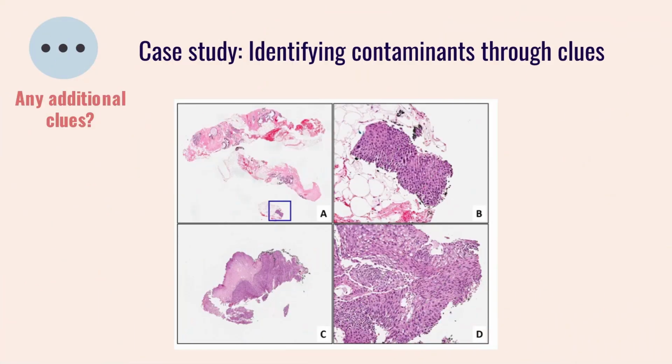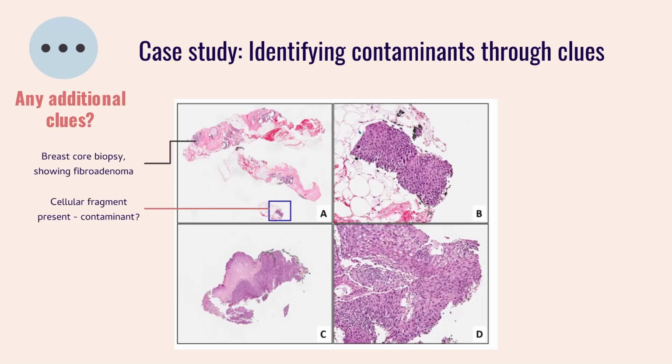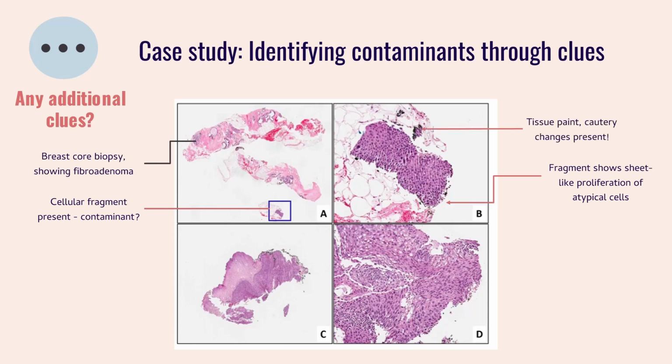Let's look at how one can apply this in a case scenario. This is a case of a breast core biopsy showing fibroadenoma, but with a cellular fragment in one corner and wedged between fat. This cellular fragment shows a sheet-like proliferation of atypical cells. One may wonder if this could be native tissue, indicating a focal area of DCIS perhaps. However, the keen observer might notice that tissue paint and cautery artifacts are present in this fragment, both of which are not usually seen in a breast core biopsy. The source of the contaminant was later traced to a looped electrosurgical cervical excision specimen with high-grade squamous intraepithelial lesion, where cautery changes and tissue paint are expected.